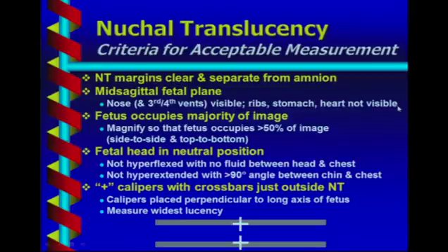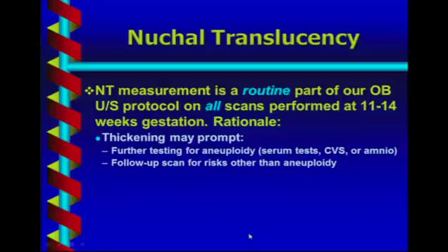I'm not going to go through each of these here, but you do have to follow very strict guidelines for how you measure it, including where you put the calipers. If this is the dark space, that's the nuchal translucency, you want to put the calipers exactly just on the outside of this dark space to get the measurement.